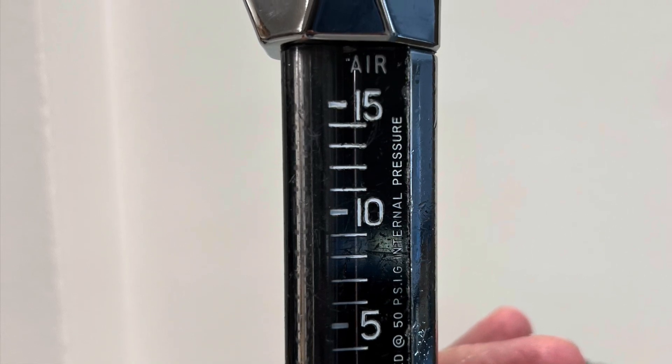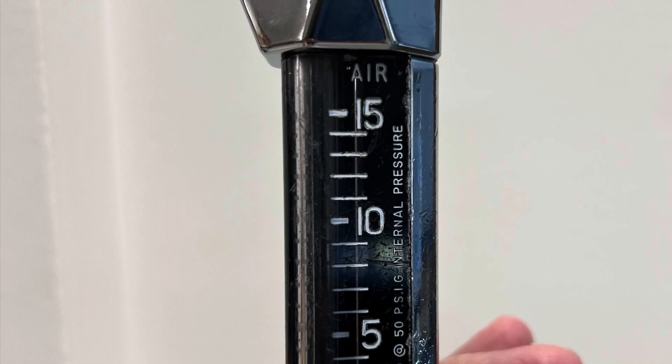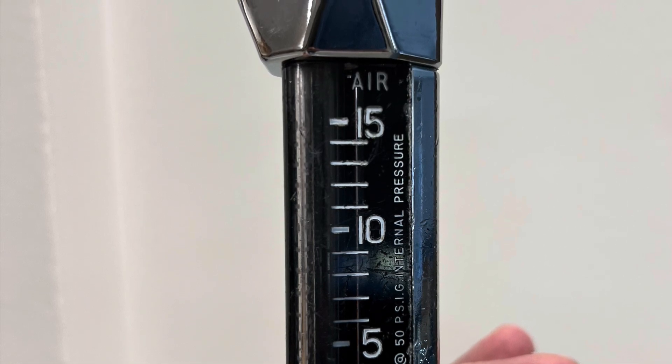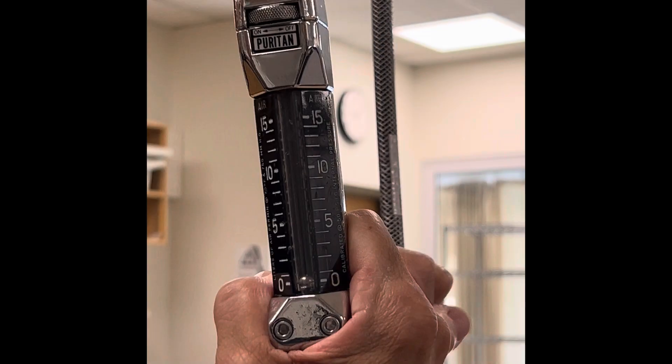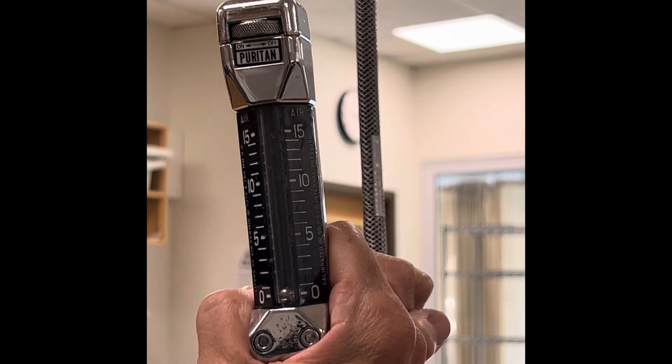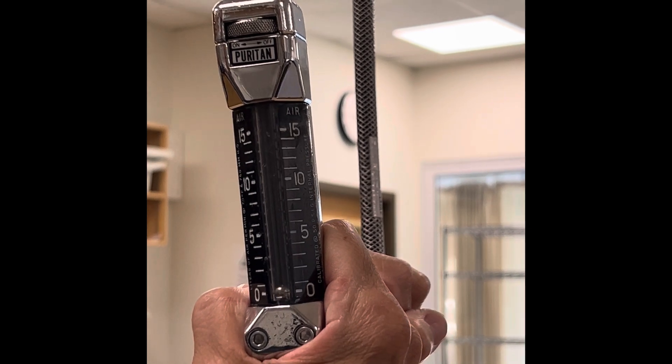Another way to tell is to take this Thorpe tube and quickly connect it into a 50 psig gas source. Even with the needle valve closed, as you see here, watch the ball in the Thorpe tube — it will jump and then fall back down. It did that right there, and if you see that, it tells you that this is back pressure compensated.